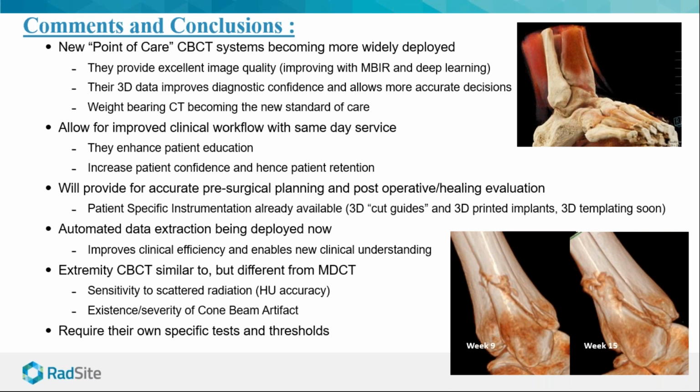When a surgeon goes into a patient to do a procedure, they'll know exactly the size of the different total knee components, for example, or total ankle components that will fit that particular patient, and they won't have to have a huge range of components that they might use as is current practice today.